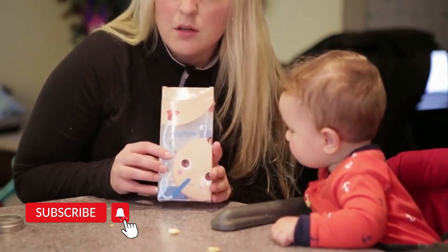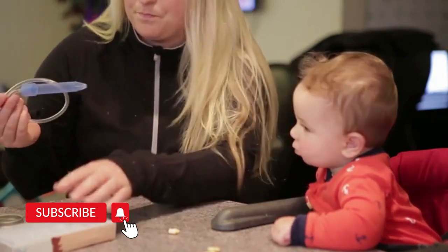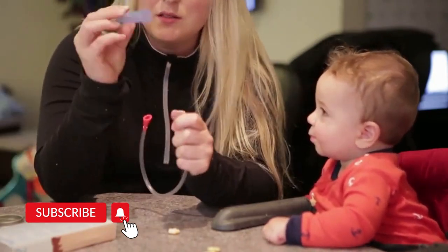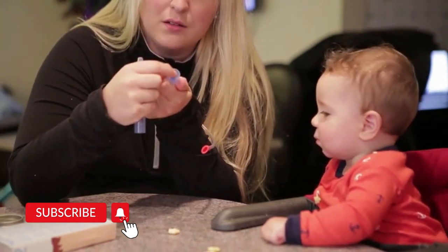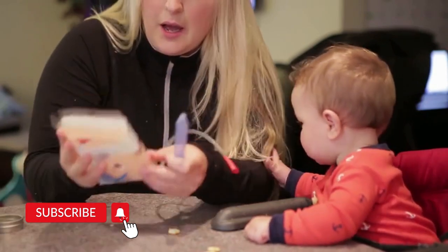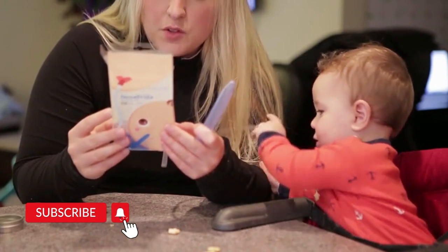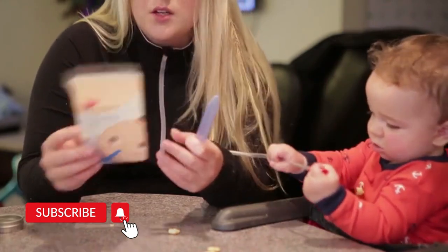This comes apart so you can clean it separately. This is a little filter, and it comes with extra filters. To clean: dispose of the filter, throw out the filter, wash the large tube with soap. Just kind of hand-washing.